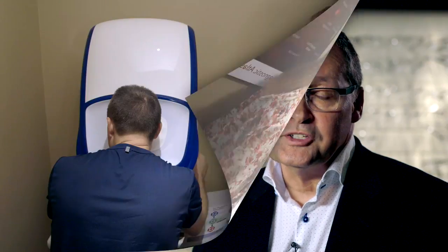It helps us to better diagnose certain diseases of the eye like macular degeneration, tumors of the eye, glaucoma, and retinal detachment and retinal tears.